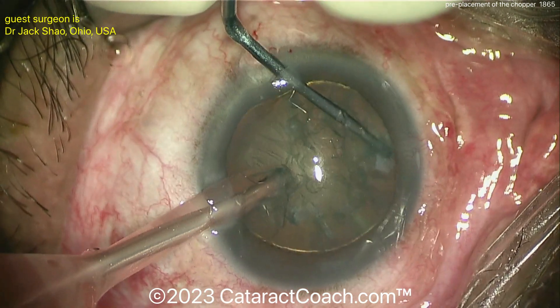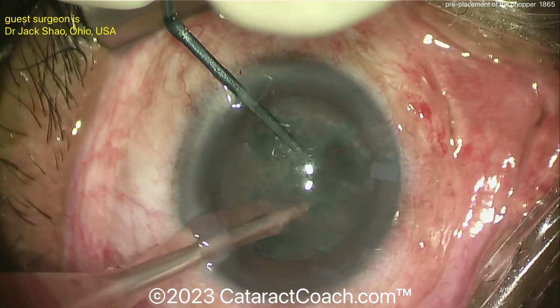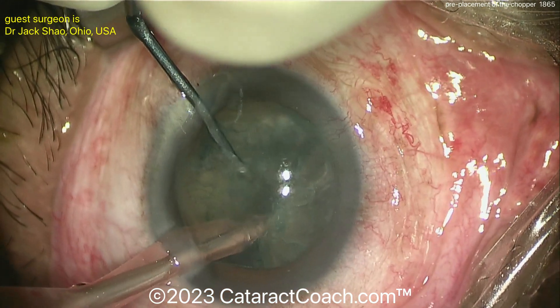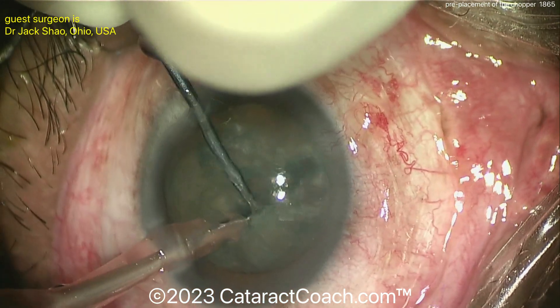Now the FACO probe is embedded, the instruments are brought together and apart, and there is your chop. Now just spend some time propagating that chop all the way through the nucleus. That looks great. So again, that's the pre-placement.